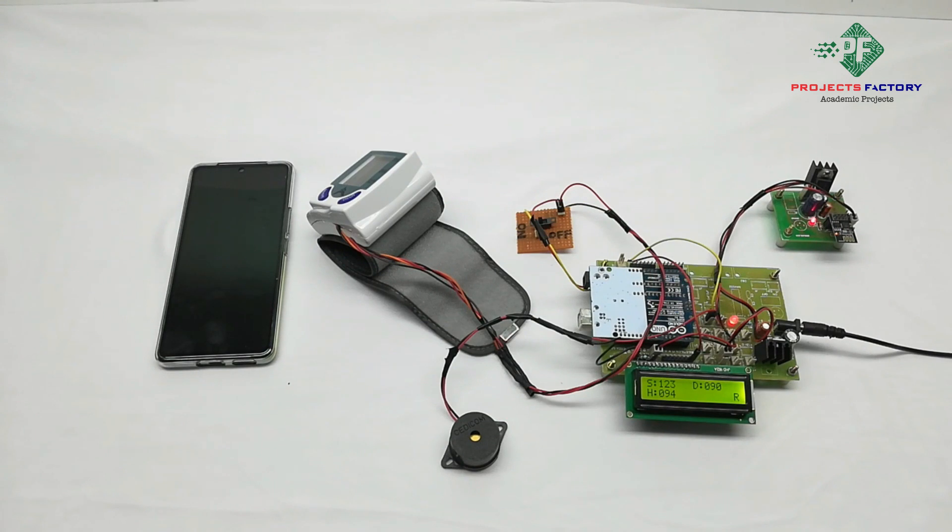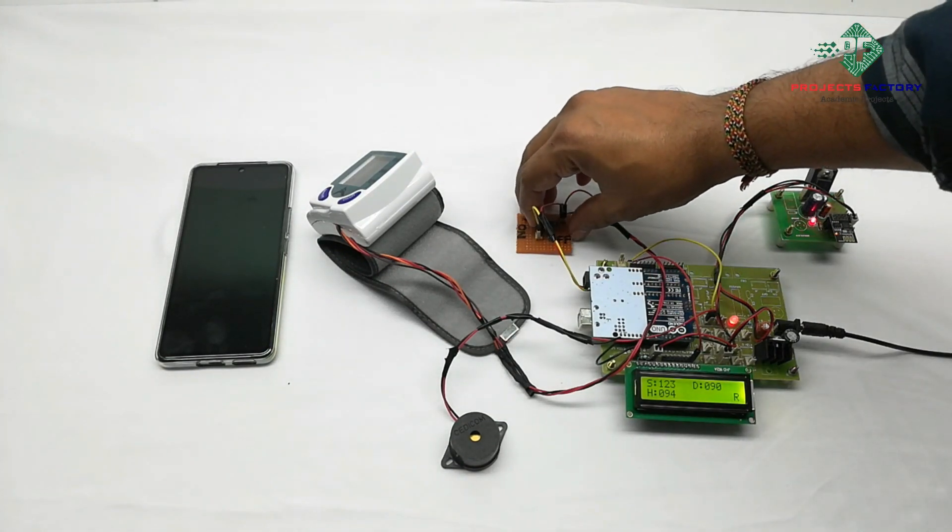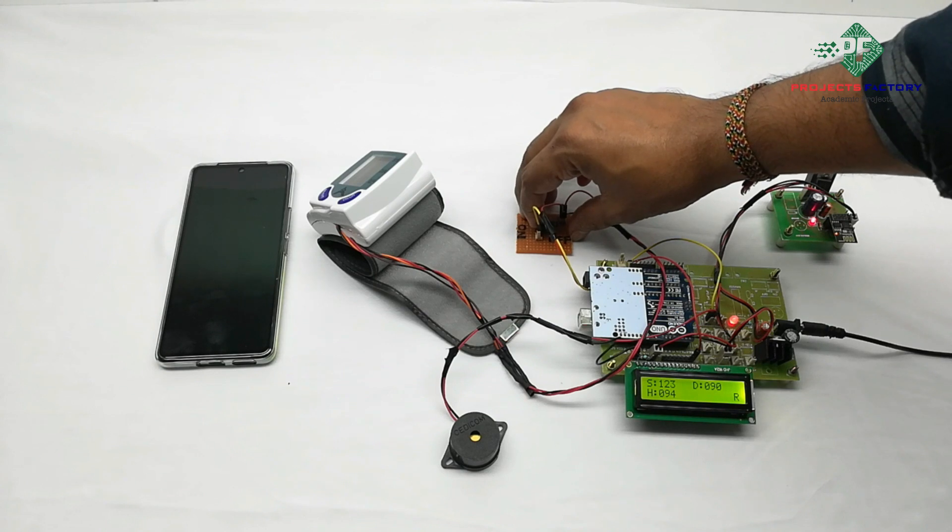After completion of the project, we have to keep this switch in offset mode to avoid leakage currents.